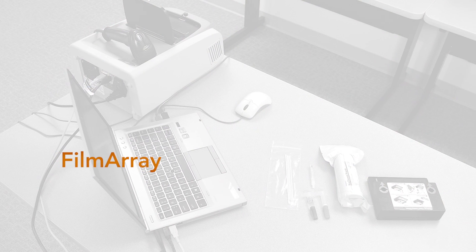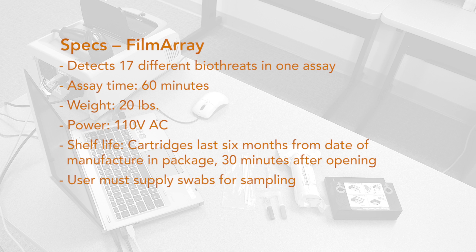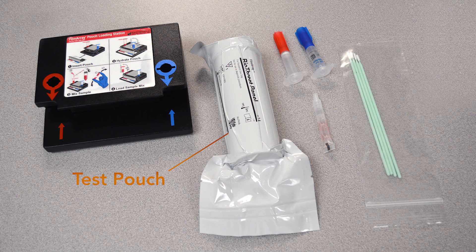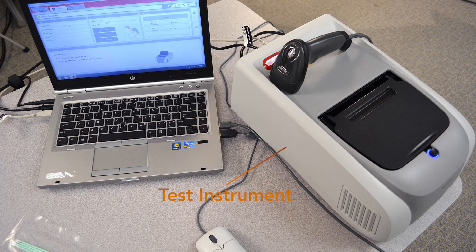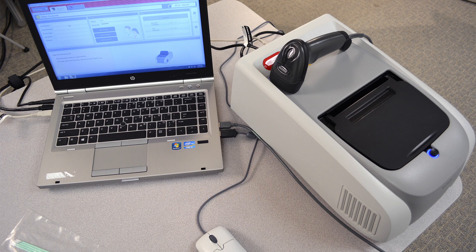The FilmArray is a polymerase chain reaction-based detection system that uses a PC-connected instrument to test a single sample for the DNA of 17 pathogens. This kit includes a test pouch, reagents, loading station, and test instrument. Users must supply their own swabs for sampling.